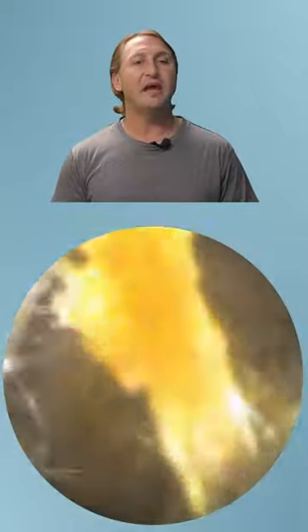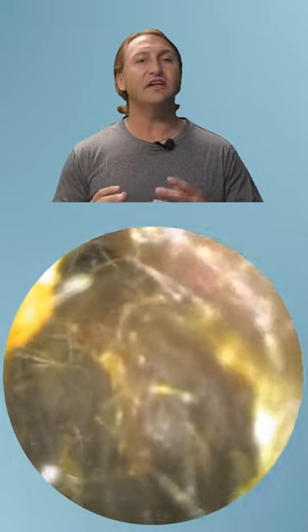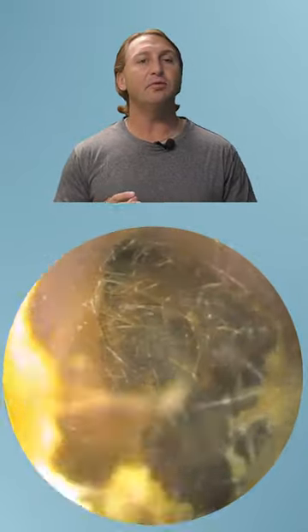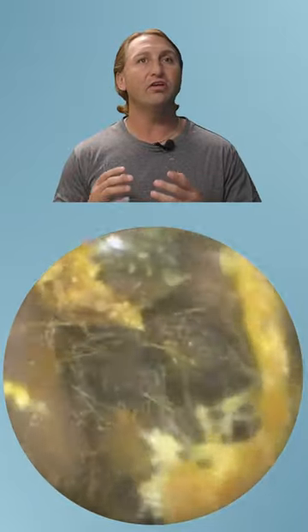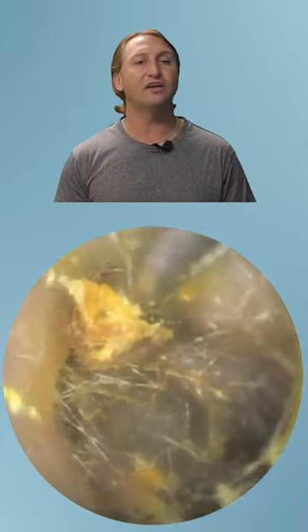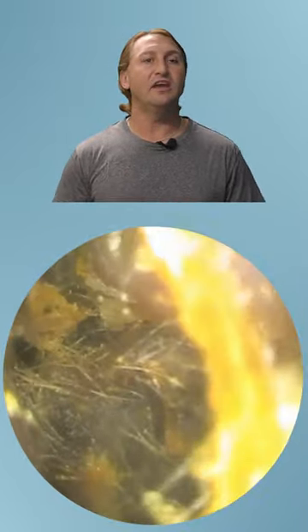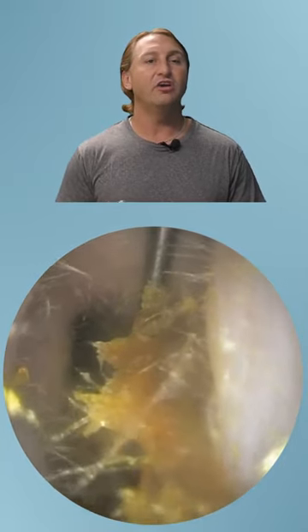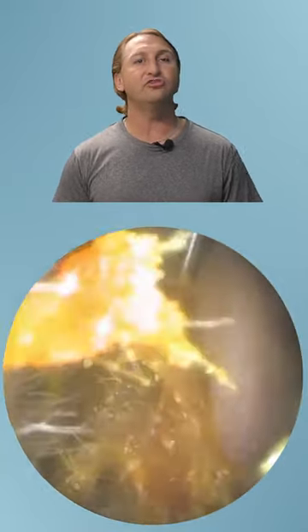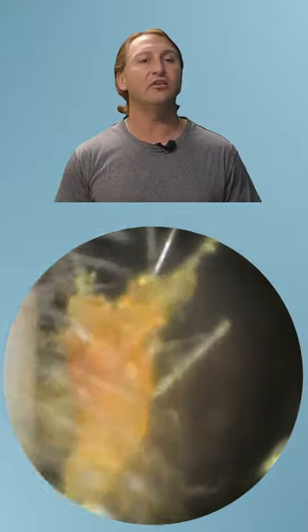Now as we head back in, you can see the outer portion is still that lighter color, but as we get deeper, it's definitely a harder, more dark colored earwax. We're going to again use the curette to get on top of that earwax and pull it out, allowing us good access to the eardrum and ear canal behind.